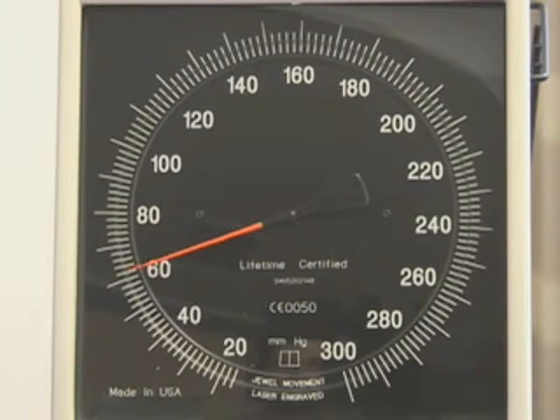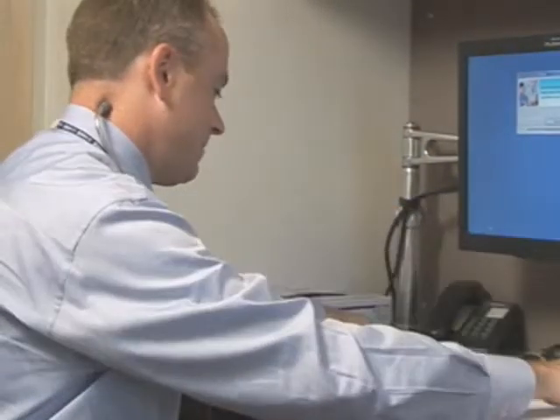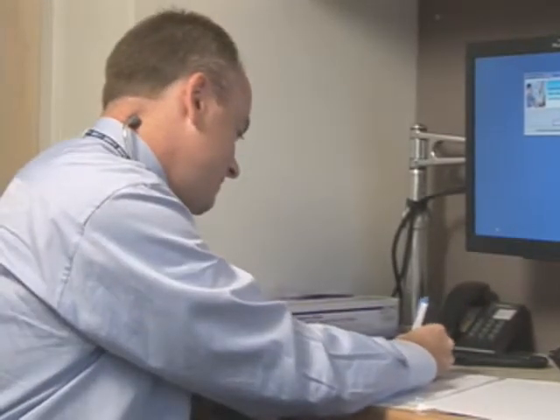To ensure that diastole has been reached, the cuff pressure should continue to be deflated for an additional 10 millimeters of mercury beyond the 5th Korotkoff sound. You should measure the blood pressure twice at a minimum, waiting at least 1 minute between readings. The average of the measurements should be recorded.